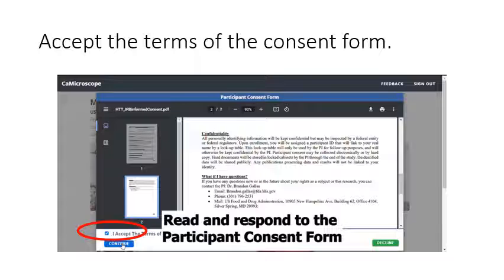After login you will be provided the participant consent form. Please read and accept the consent form. If you wish, you may download the consent form. Then click continue.